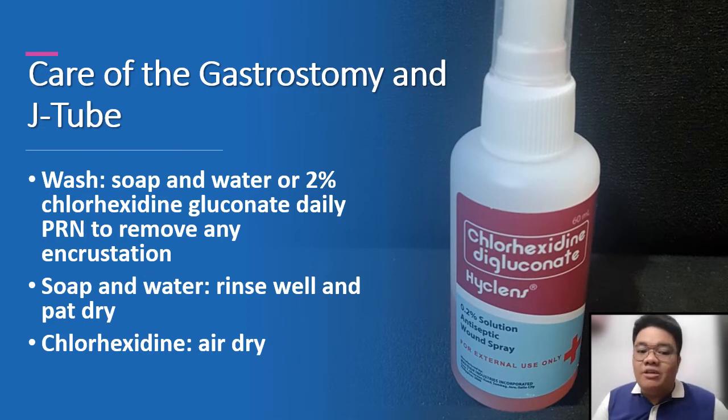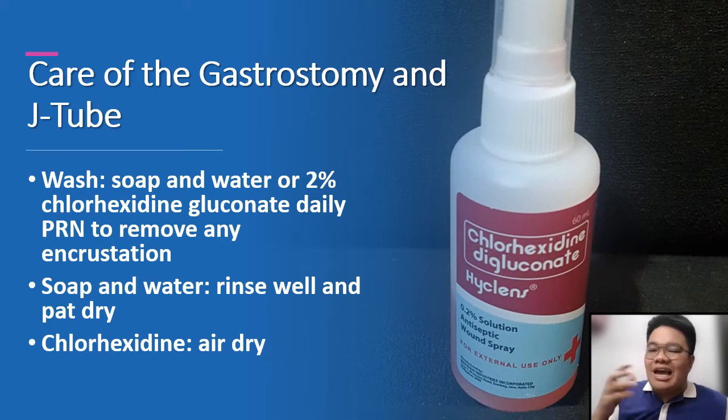Now, for the soap and water, you need to rinse it well and pat dry. If it is chlorhexidine, just allow it to air dry. Okay, on the right of the slide is an example of the chlorhexidine product that we commonly use for wound care.